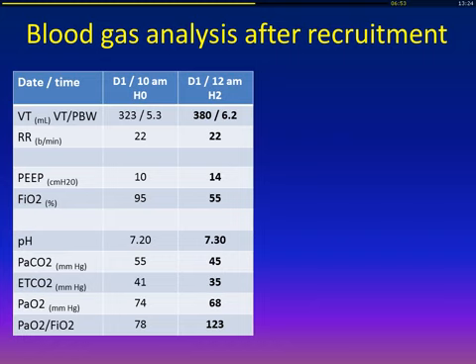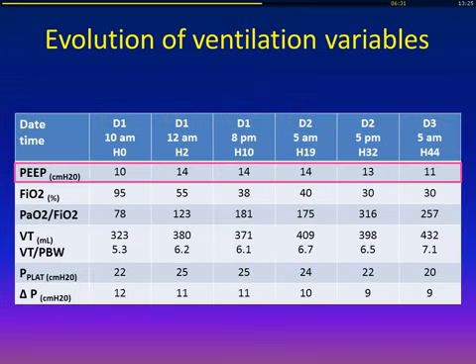So that we keep a minimum PEEP and we let a little bit of space for the PEEP to play in case of disconnection, suctioning associated with de-recruitment. And so we have a blood gas with this level of PEEP. You see that FiO2 decrease and the PF ratio increase, and the PaCO2 was partially corrected.